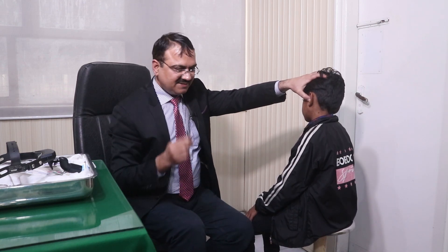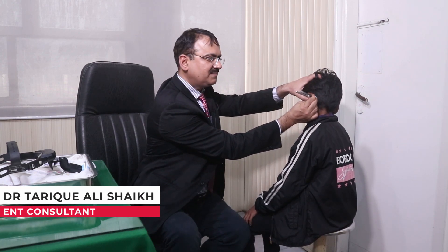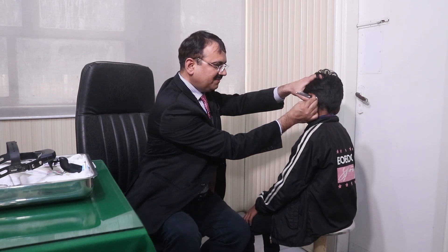You have to block the ear canal and then strike the tuning fork. Ultimately, the mastoid tip placement will be used. Yes — the sound is gone once you move it away from the mastoid.